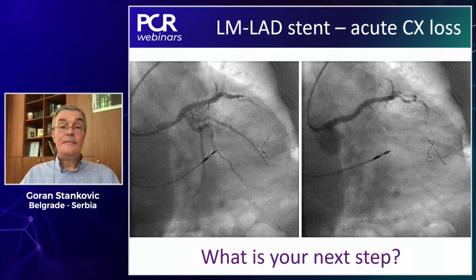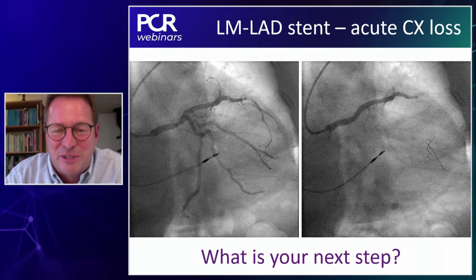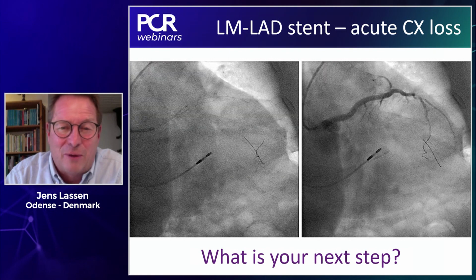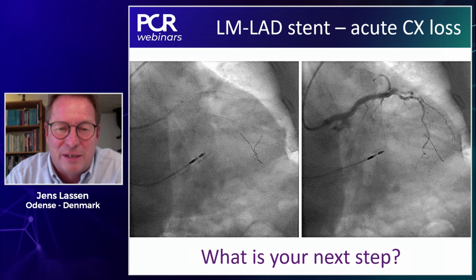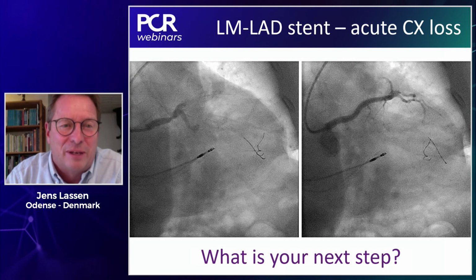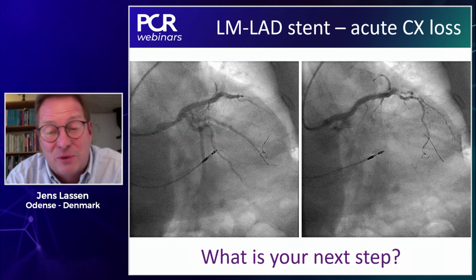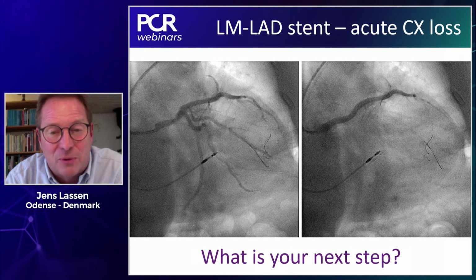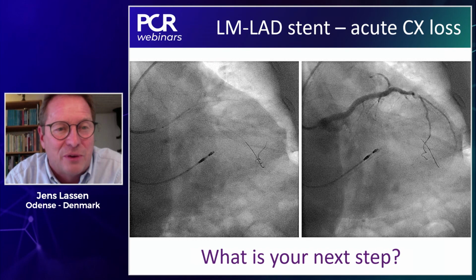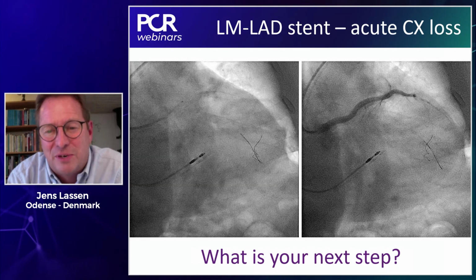Well, you described the situation so well, Goran, and I guess we have been in that situation, all of us. I think my first reaction is actually how I avoid my glasses being damp, and to bring my own heart rate a bit down again, and then realizing that the patient, not only because of the closed vessel, but also maybe because of impairment of the papillary musculature, has some mitral regurgitation and deteriorates very quickly. So this is really, really risky.